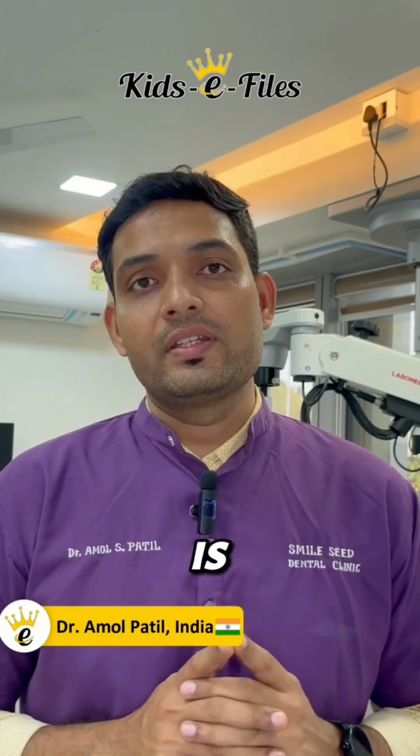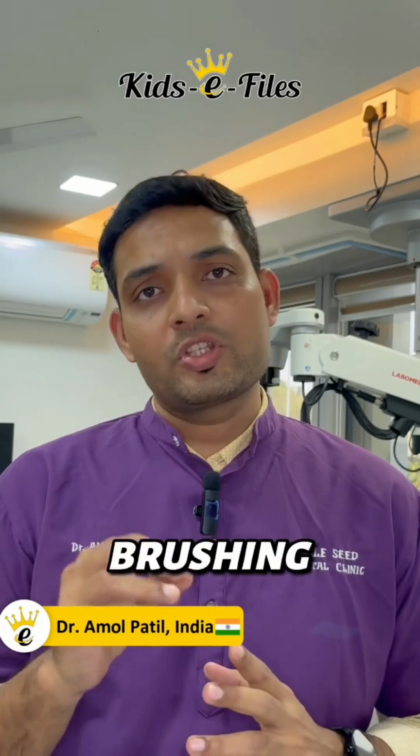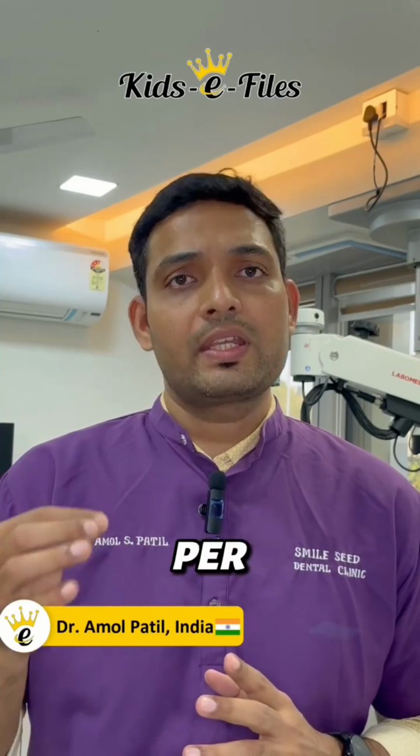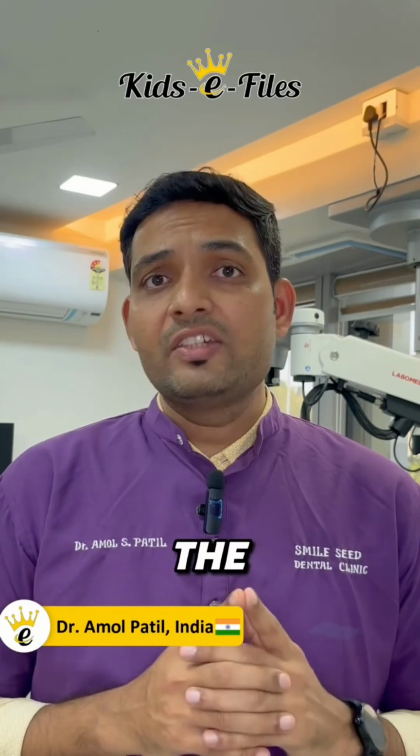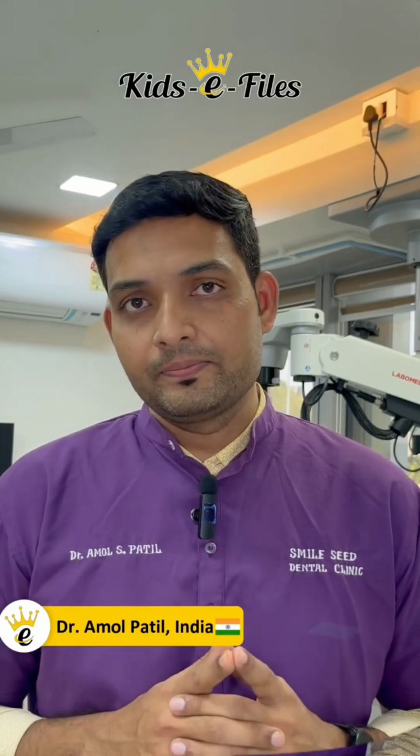The clinical tip over here is do not force the file apically. Use the file in pecking or brushing motion 3 to 5 times per canal. Always clean the file after every insertion and irrigate the canal after every file.